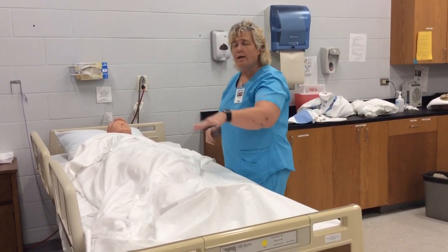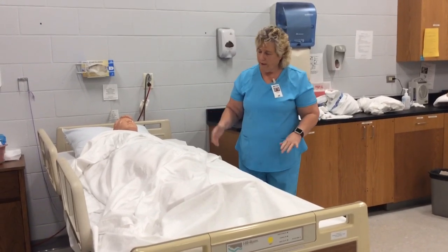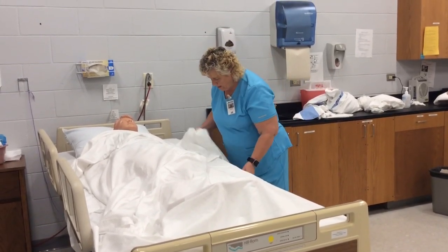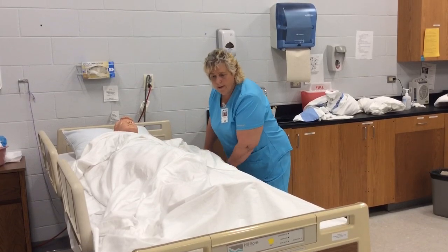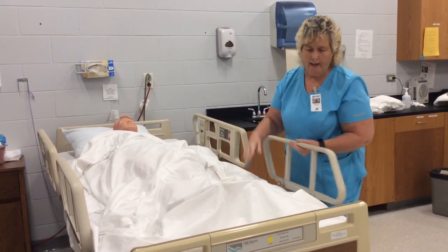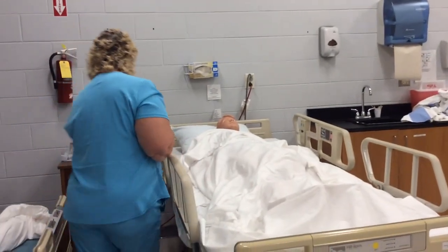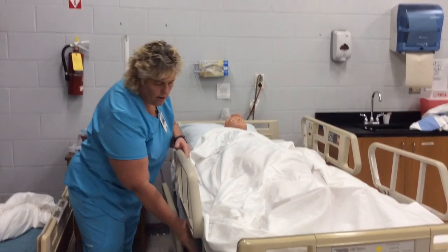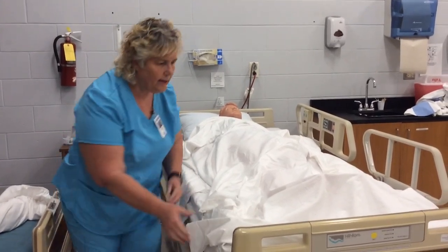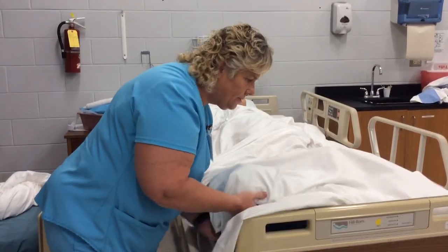So I need to go to the other side. This is what can happen sometimes. You want to get over there and finish, but you need to put your side rails up because you're leaving the bed with the bed up. And then I'm going to come over here, and I'm going to put the side rails down. And that's going to go over there. I'm going to lift the bed up just a little bit.